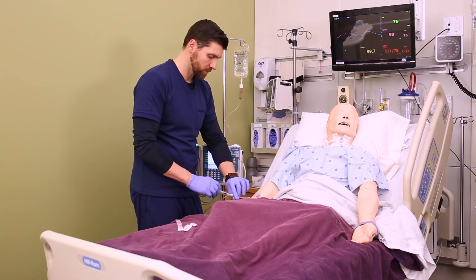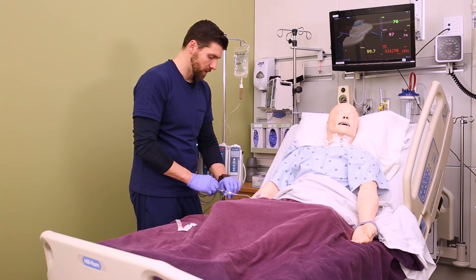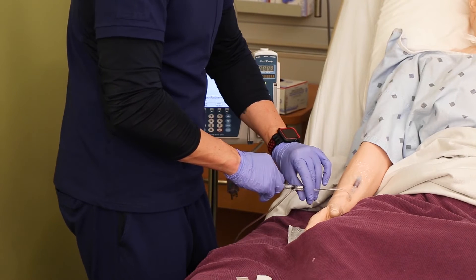The good thing here is these fluids are going to push the drug in for you, so you don't have to worry about how fast you're pushing your thumb or how strong you're pushing it. You can be sure that you haven't administered it too quickly.